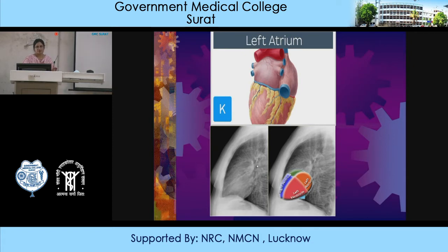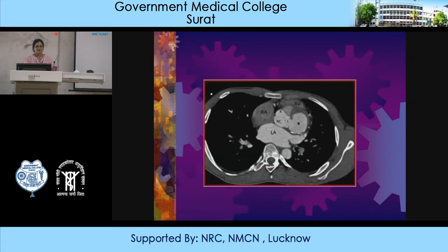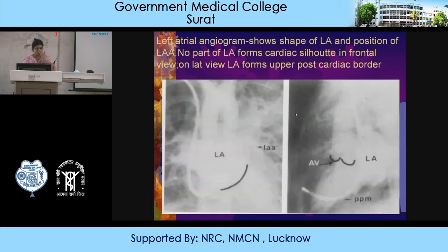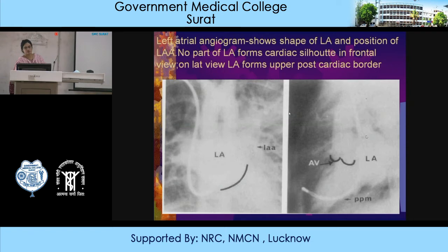On an axial view, you can see the left atrium receiving the pulmonary veins, the right atrium, and the right ventricle situated anteriorly. The left atrial angiogram shows the shape of the left atrium and where the left atrial appendage is seen. No part of the LA forms the cardiac silhouette on the frontal view, but on the lateral view it forms the upper posterior cardiac border.